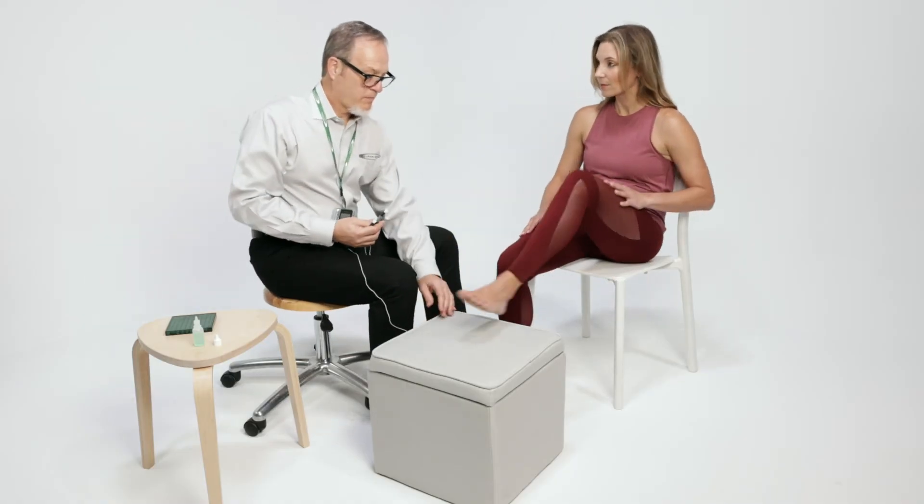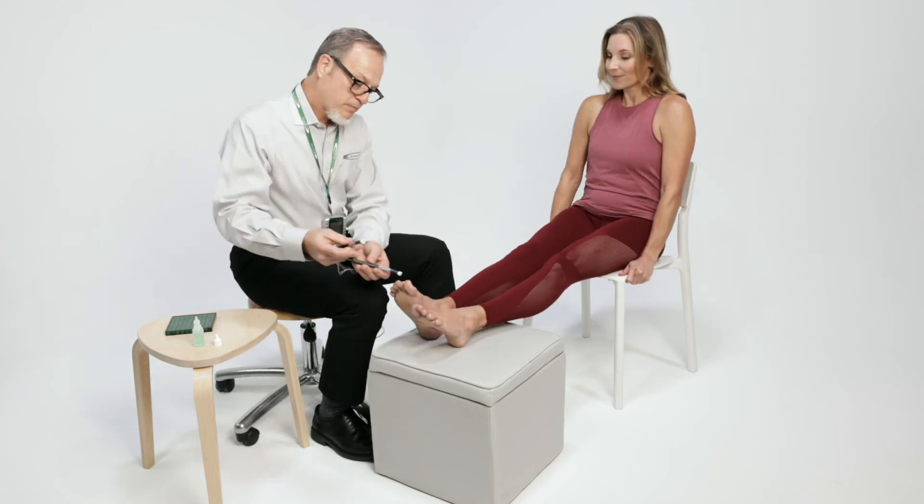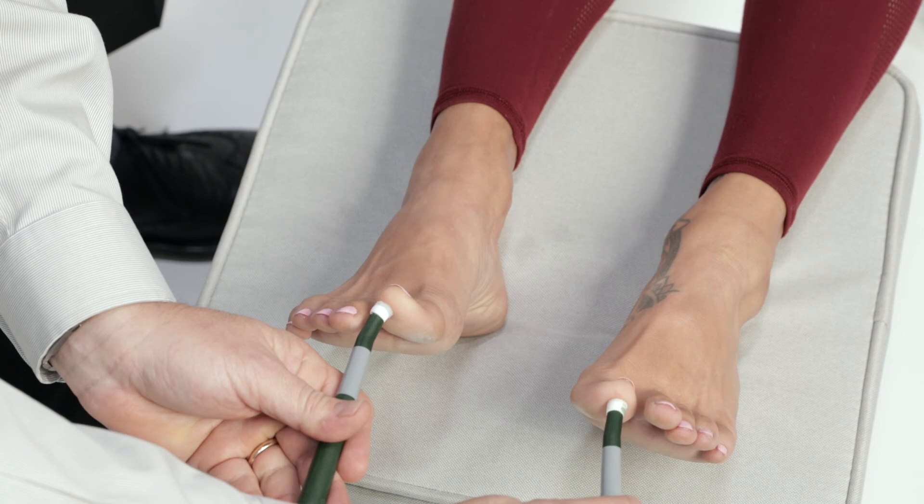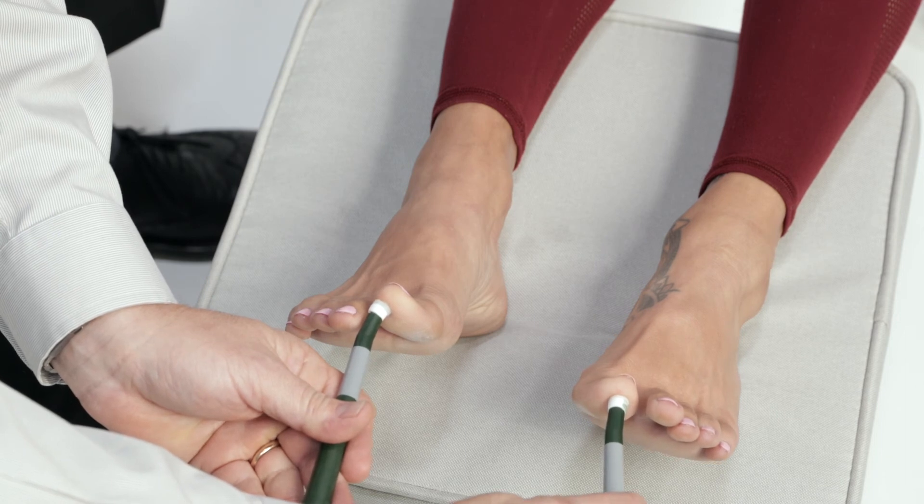The same strategy applied to the toes can be used to treat any problem in the legs, such as pain in the toes, feet, ankles, and knees, but not the hips. Hip pain requires local probe treatment.